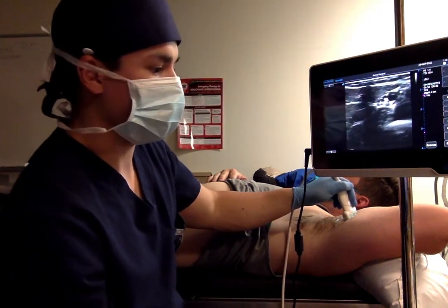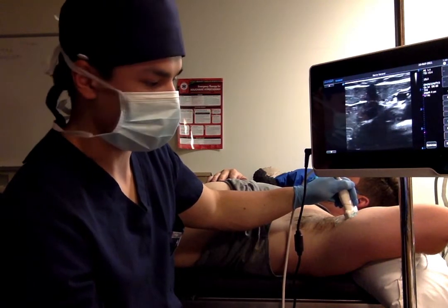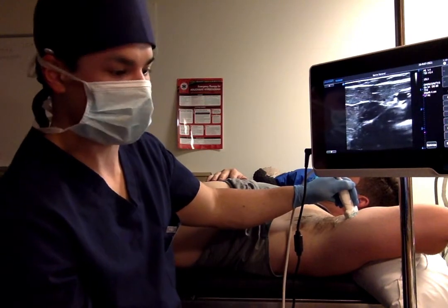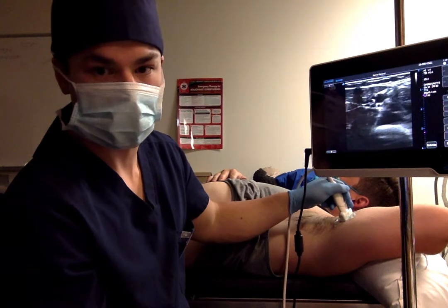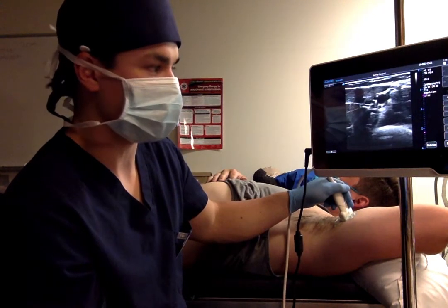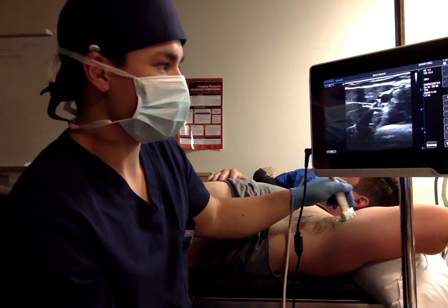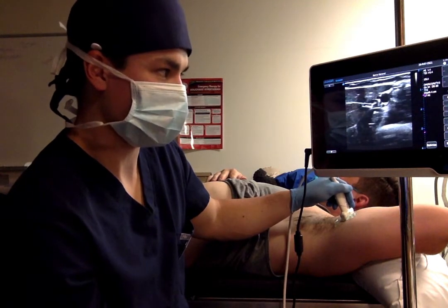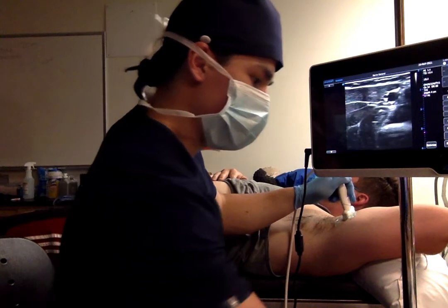Once again, the patient is sedated with 1 to 2 milligrams of Versed, 30 milligrams of ketamine. The reason why we want this patient awake for this block is because it can result in local anesthetic toxicity, and we want the patient to be able to tell us if they have any symptoms such as tingling in their mouth or around their mouth or in their ears. And in case we go intraneural and inject, that can cause some severe pain. So I'll grab my needle.